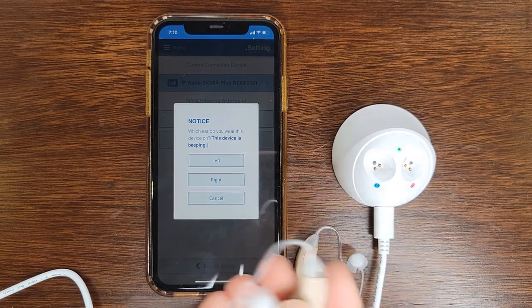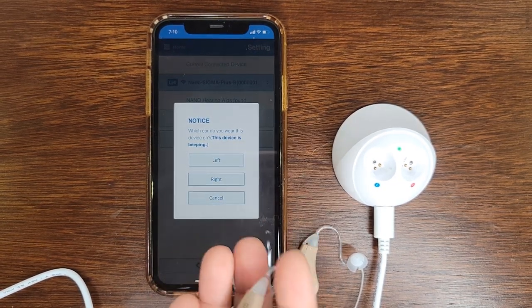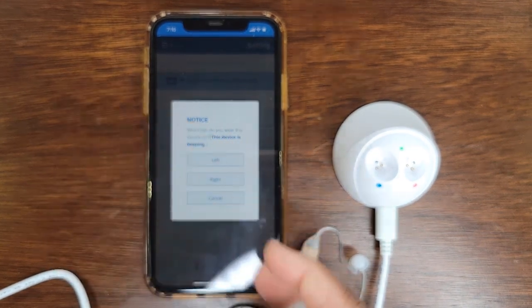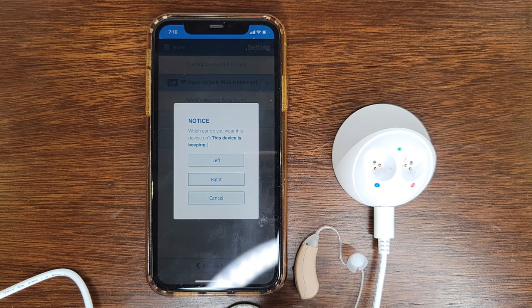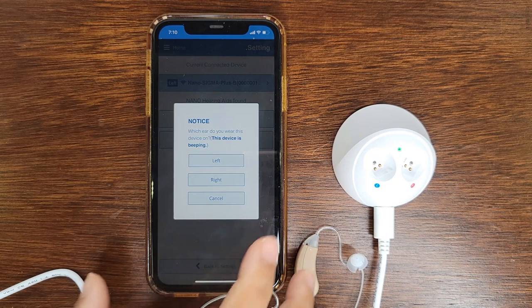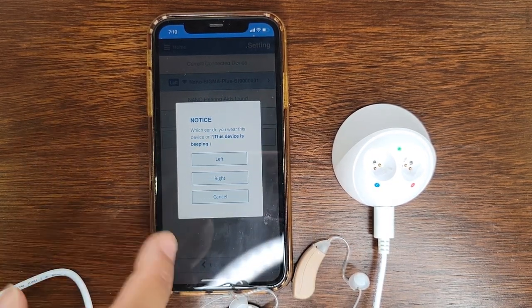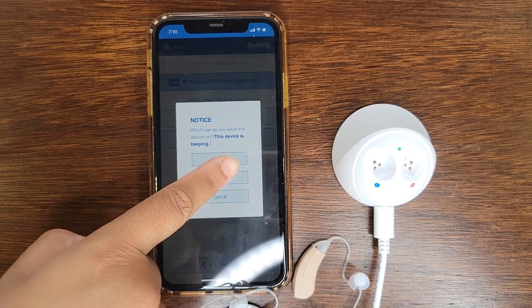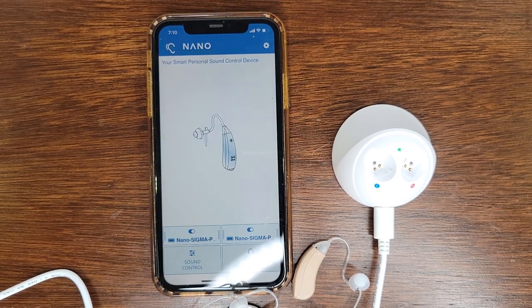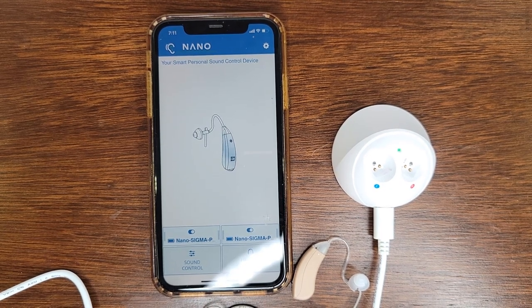Just a quick tip, when you try to connect it, make sure that you long press the rocker switch on the top until you hear a beeping sound, and this is the beeping that it's giving a notification for. So if you heard that beeping sound, you can select which ear it is for and select yes. So now both of my hearing aids are connected, so we're gonna test it out.